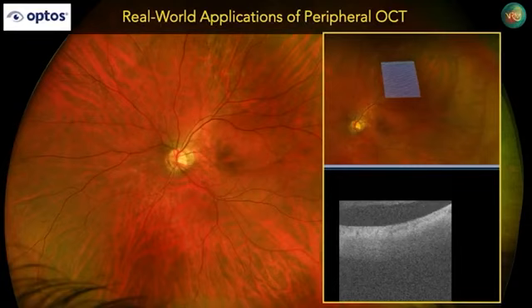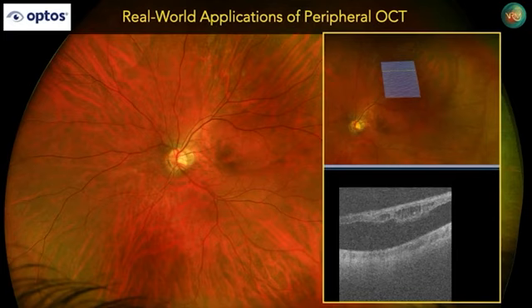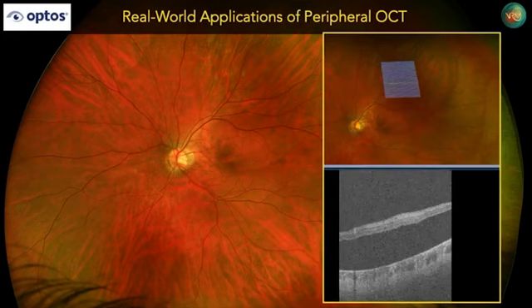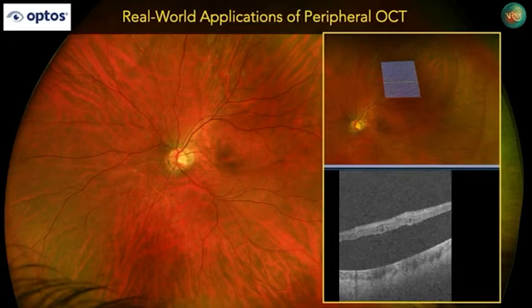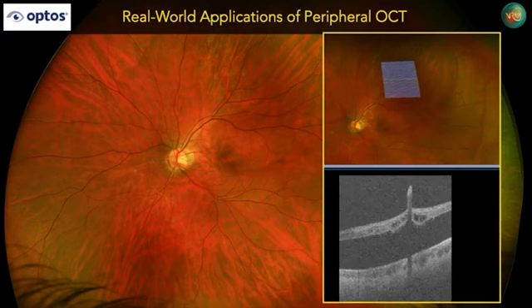As you can see, we did a raster line scan over the suspected area. And you can see that there's intraretinal fluid, and there's also here this central focal break. So this patient actually had a largely posterior pole and somewhat mid-peripheral retinal detachment that had been sort of lingering along, and we were able to locate the break. He had a pneumatic retinopexy, which was done with an injection of gas followed by laser, and he did very well.